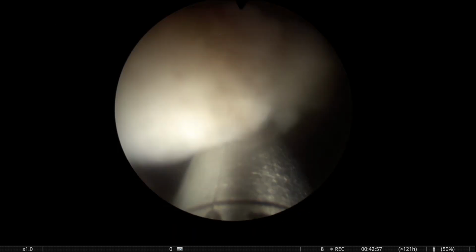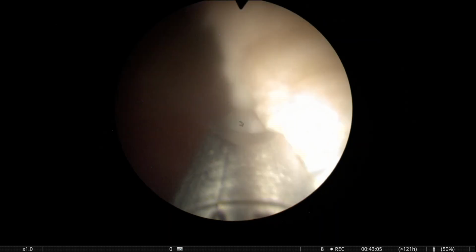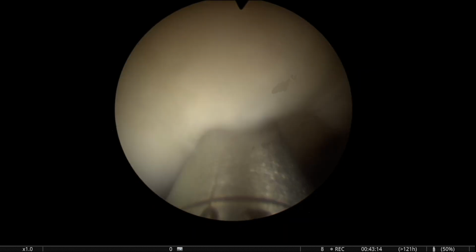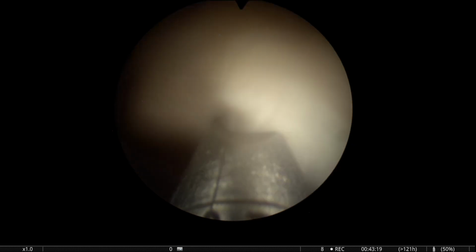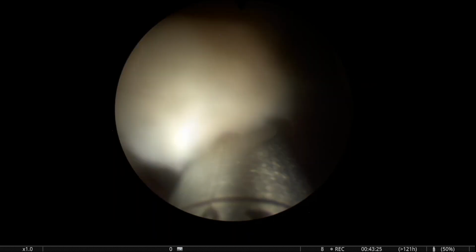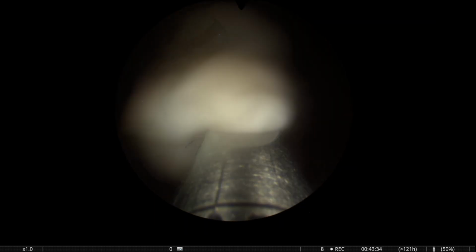And I have to say, if you stick to the basic principles of how to use the energy, especially recognizing capsular deepening and modifying your line so that you get closer to the adenoma to prevent deepening even more, if you use a soft energy for dissection, if you are organized in your steps, so you know the basic science, the basic principles of how to use the laser, and then you follow a sound strategy, carrying the lines, connecting the lines, so you have a good reference of where you are, then it becomes a very affordable procedure and also very fast.